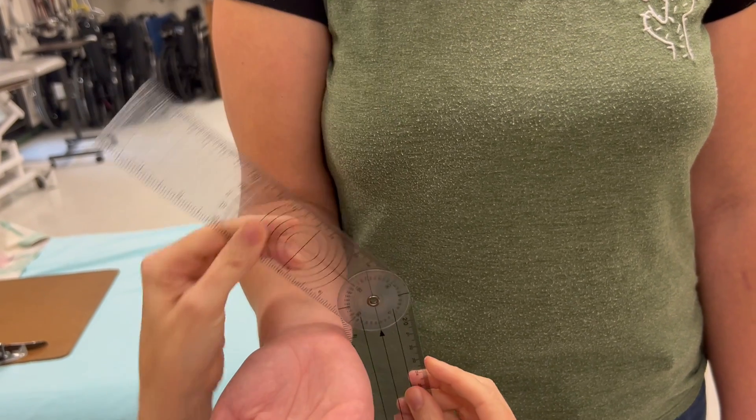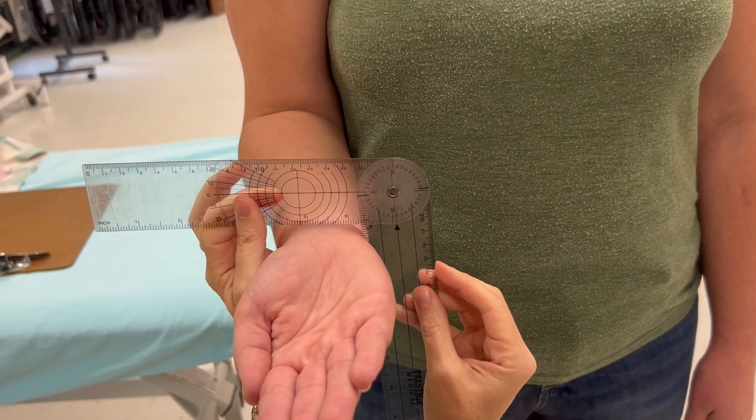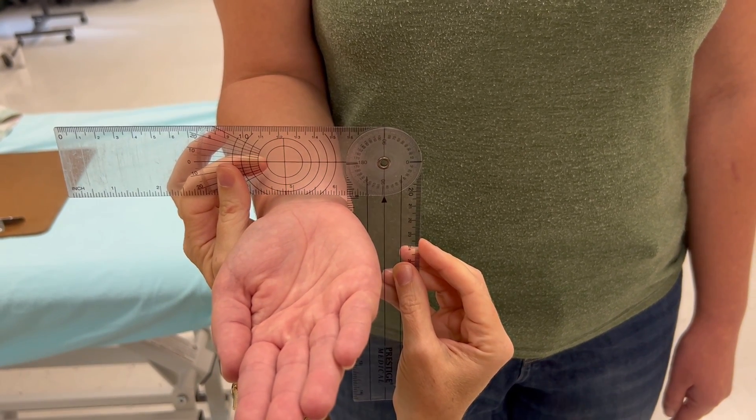So there's my zero — making sure I'm not losing my zero. She's at about 88 degrees for supination.